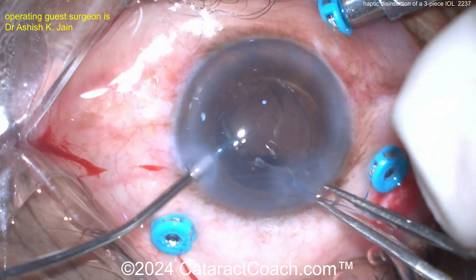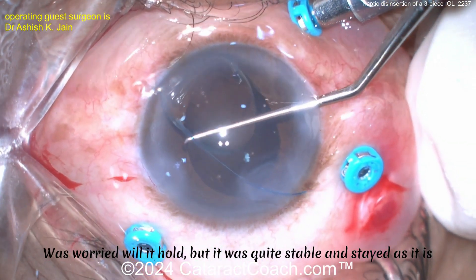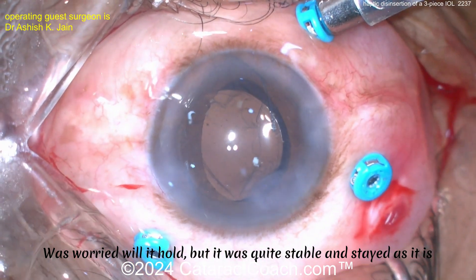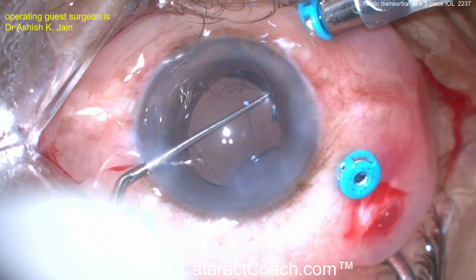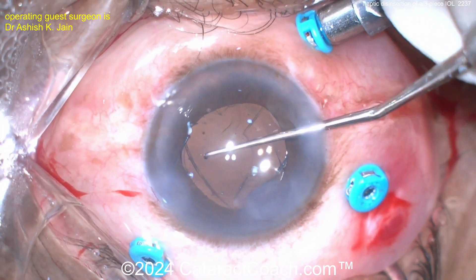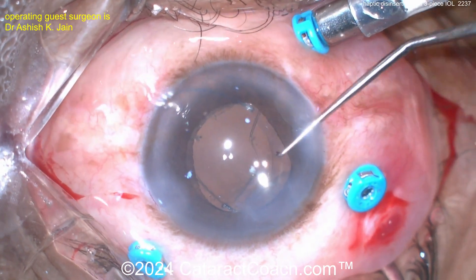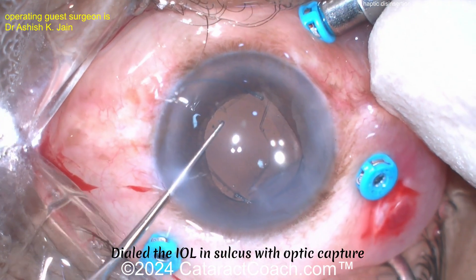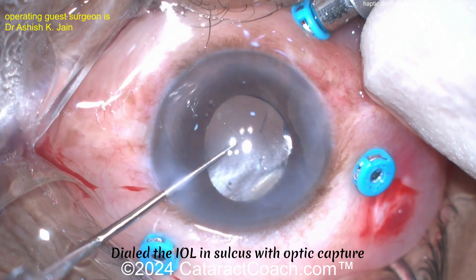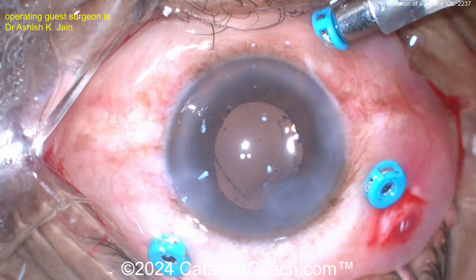We've shown videos here on Cataract Coach before where a vitreoretinal surgeon would use the endo laser to burn around that haptic-optic junction just to make sure it gets melted in and doesn't move — though that's not absolutely required. You can reinsert the haptic, and it looks like it's staying. If you have any doubts, just get rid of that lens and use your backup lens. But the surgeon here is able to get this case salvaged — there it is, lens in the sulcus. Not sure if we'll get an optic capture, maybe.